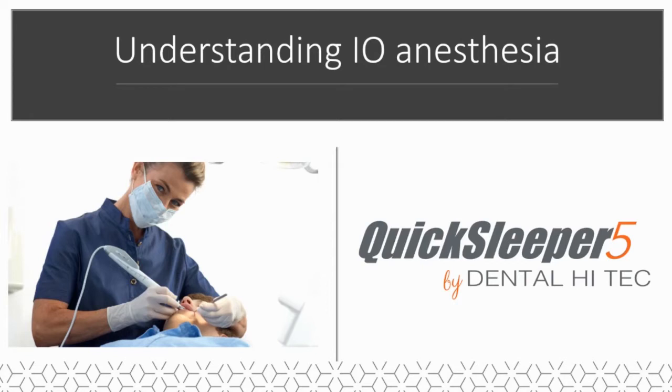The aim of this short video is to introduce the main characteristics that make this technique such a game changer when it comes to the delivery of local anesthesia injections. It will help you understand how it works, when to use it, and it will also supply a number of tips to ensure an optimal user experience and complete patient comfort.